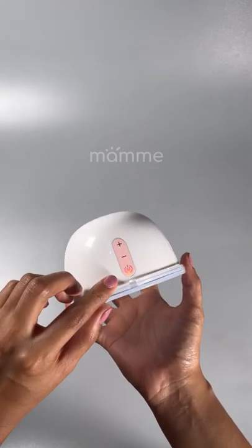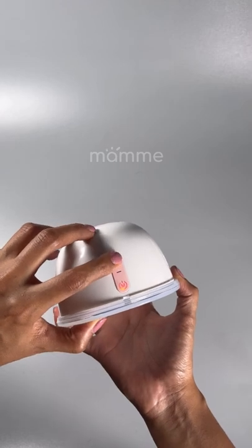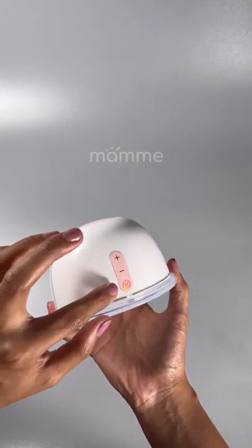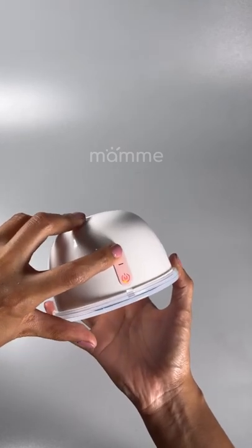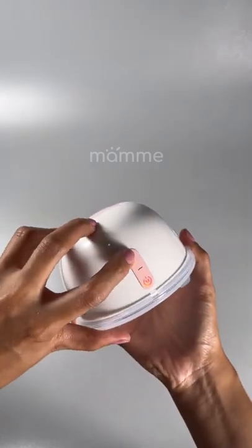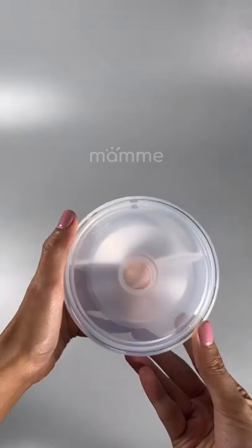Okay. So, how do we increase the levels? Just press the plus sign. 2, 3. Until the highest level, which is 9. So, paano natin malalaman kapag highest level na, mag-blink ang red symbol na to. Yan. So, hindi pa siya nagbo-blink. Pero lumalakas na ang suction. Ayan. Hindi pa nagbo-blink. Ayan, nag-blink na. We are now in the highest level of massage mode. And it looks like this.